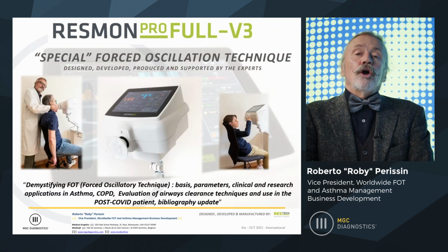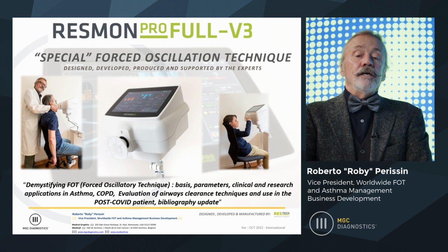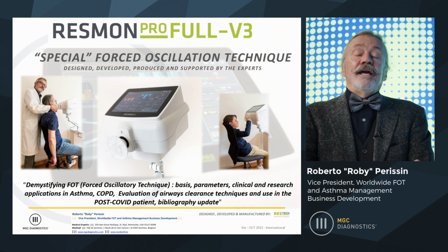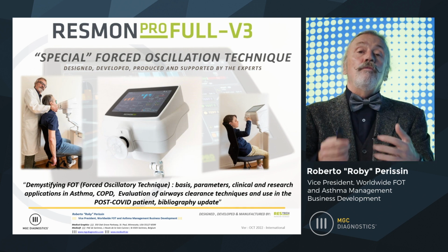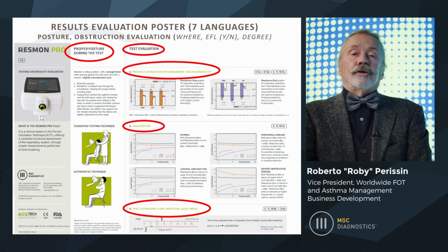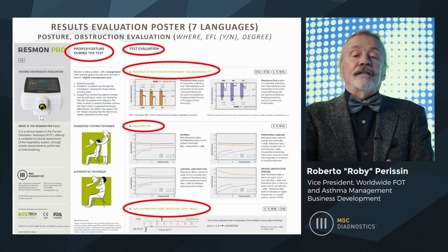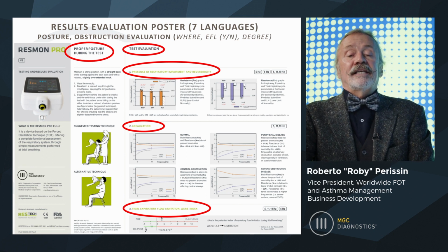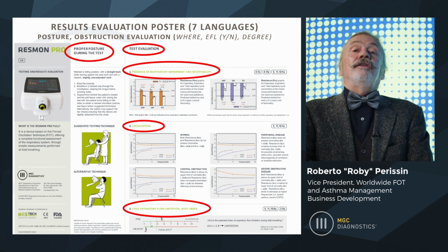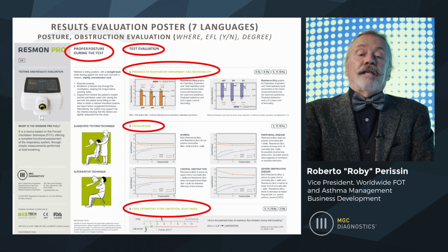The seminar is called Demystifying FOT: the basis, the parameters, the clinical and research applications in the different uses, and the bibliography update. Again, this is available by Zoom or in person. And last but not least, the poster that we have developed in several languages that basically will help the operator to look at the test evaluation, the localization of the test, and the quantification of the expiratory flow limitation.